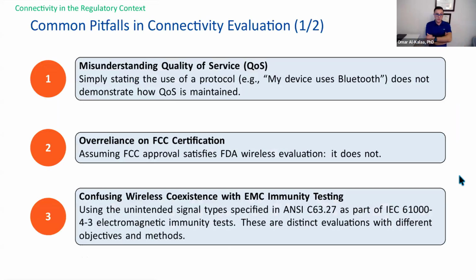But moving on, I want to quickly highlight a few pitfalls in the evaluation of connectivity that I've seen over time. And I'm hoping that this is of value to the attendees. Misunderstanding of quality of service. By far, this is the most common issue that I've seen. And it is the central topic of many, many conversations that I continue to have to this day.